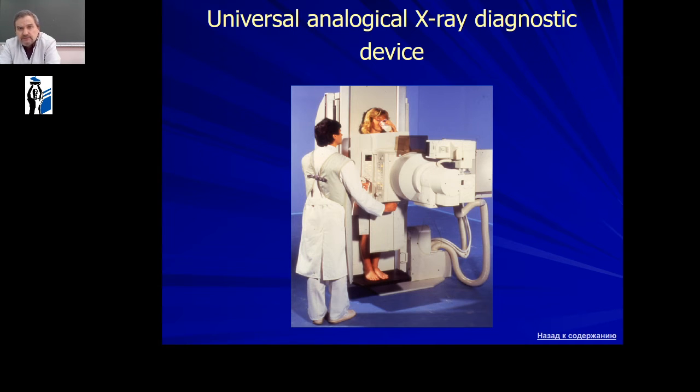On this slide, you can see a universal analogical, or analog, X-ray diagnostic device. We can see the patient, in the center the X-ray tube, and the radiologist or X-ray technician.